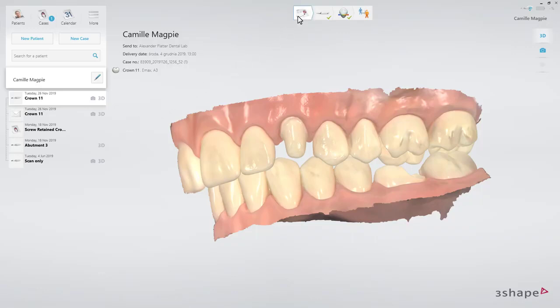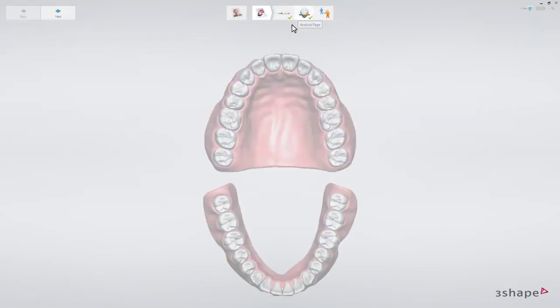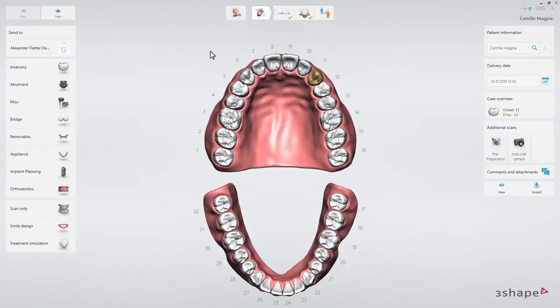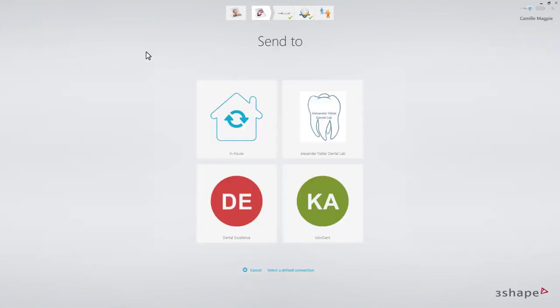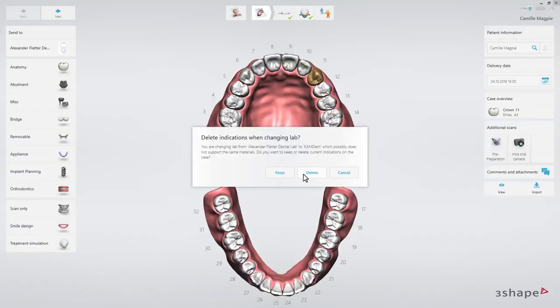Now perform the changes you need. For instance, change the lab to a different one. To do that, select a new lab in the Send To section, and choose a different lab.